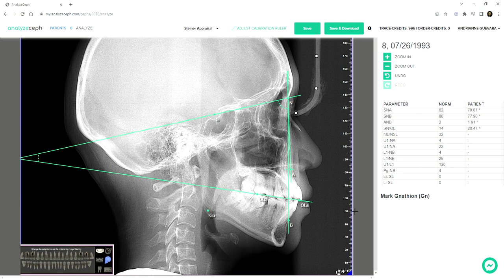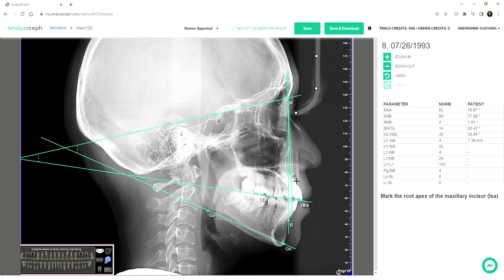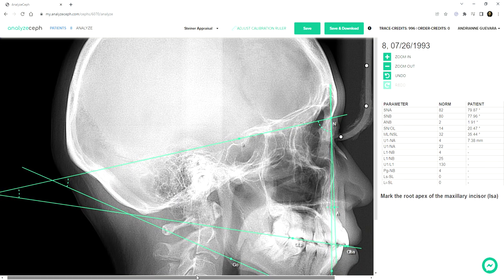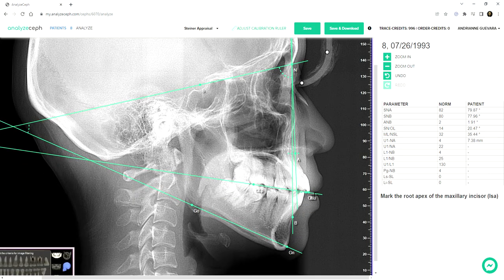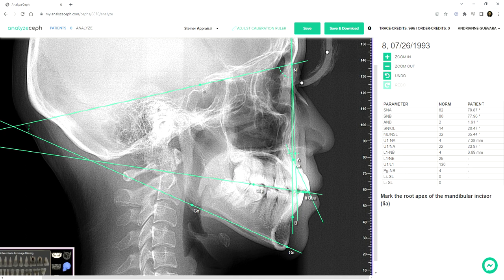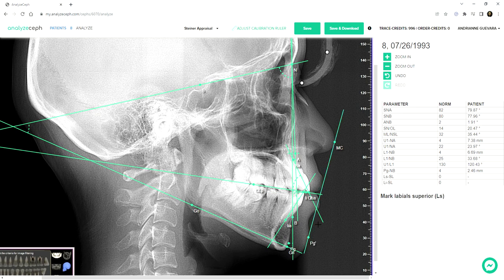Let's mark Gnathion. Incisal edge of the maxillary incisor and the root apex. If you cannot clearly see it, you can actually zoom it in. Next is mark the incisal edge of the mandibular incisor — it's here — and then the root apex. Then mark Pogonion, the tip of the nose, soft tissue Pogonion, the upper lip, and the lower lip.